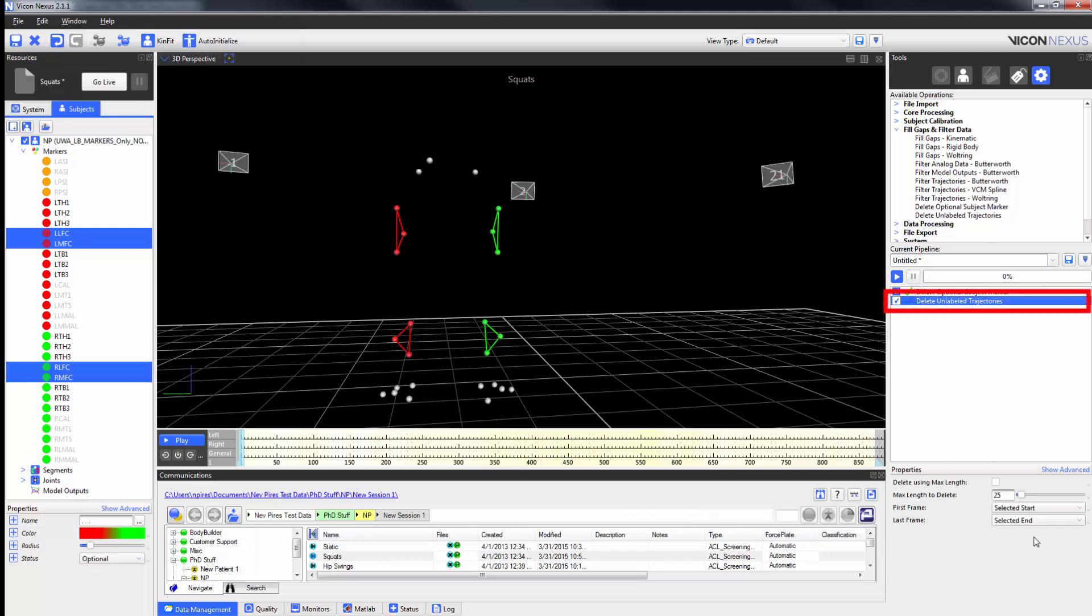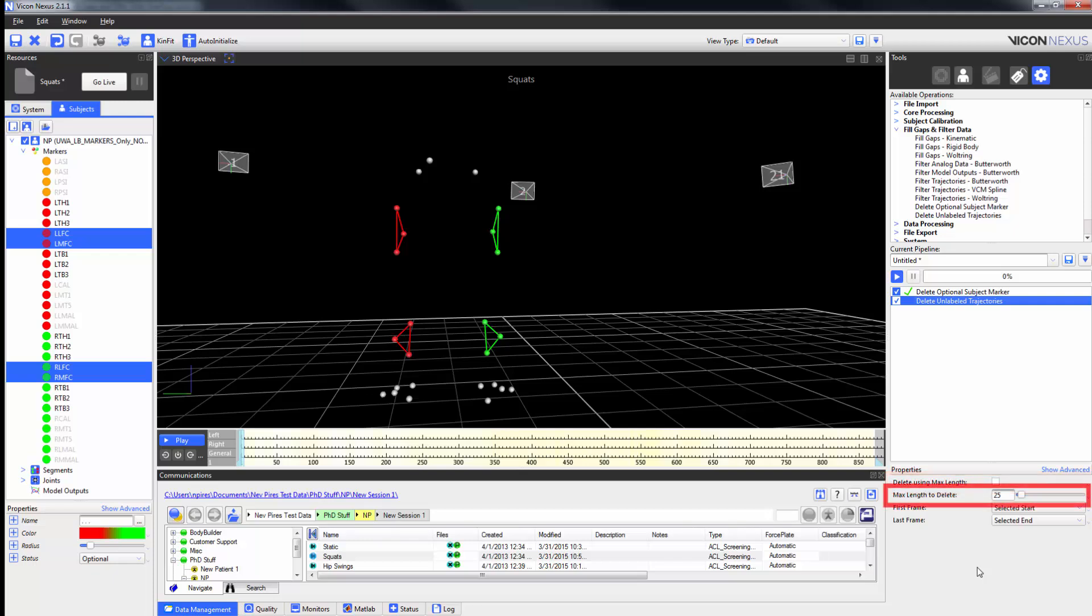Underneath the Delete Unlabeled Trajectories Pipeline Operation Properties, we can check or uncheck Delete Using the Max Gap Length, we can alter the Max Gap Length, and we can change the first and the last frame.